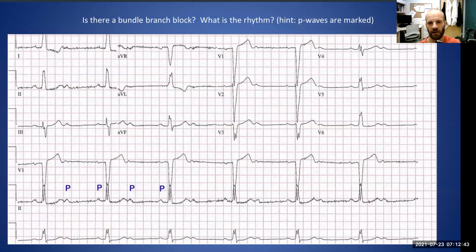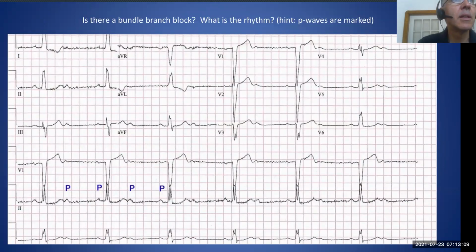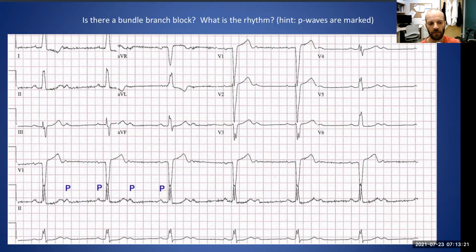What rhythm's going on? The second part of the question. I didn't completely get that. What was meant by what rhythm? Okay. So do you remember we did the lecture on rhythms, we're referring to the last classes. Let me take a look at this. Well, it seems regular. It does, yeah. And yep, good start. Yep, so work through it systematically. Excellent. So it looks regular.